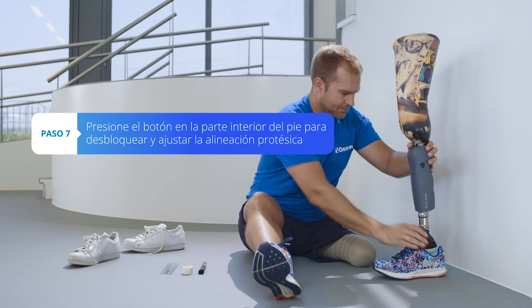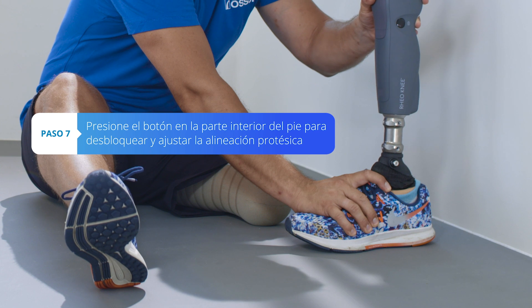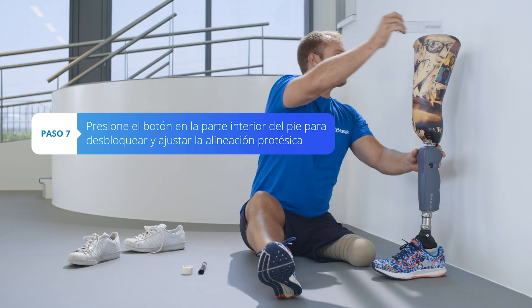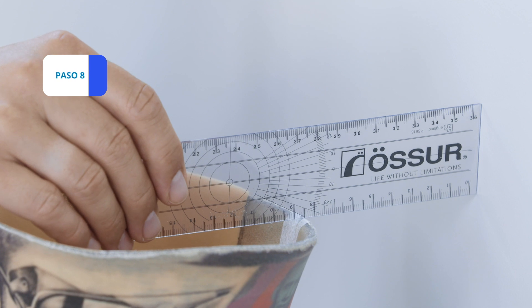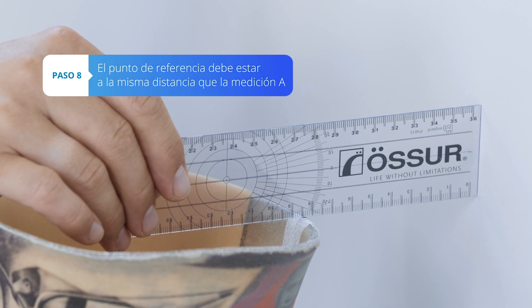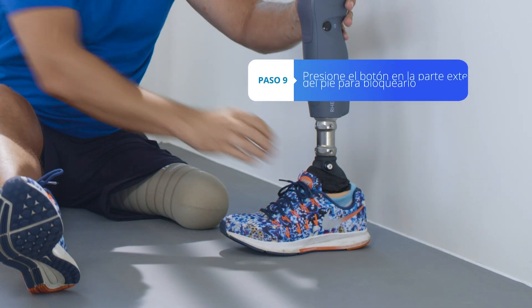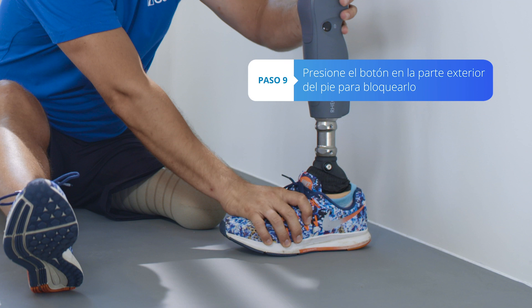To adjust the foot angle, press the inside button to unlock the ankle. Hold the foot firmly and move the socket backwards or forwards to restore measurement A. The reference point should always be at the same distance as measurement A. Important: push the outside button to lock your ankle.